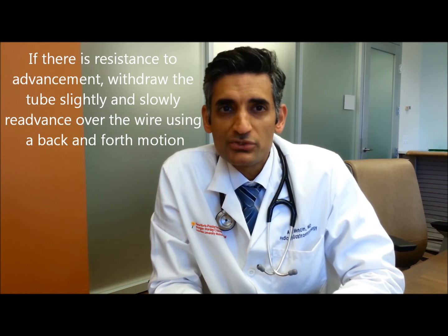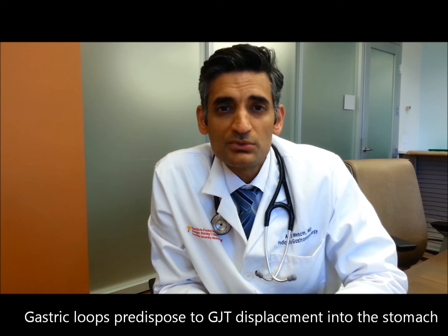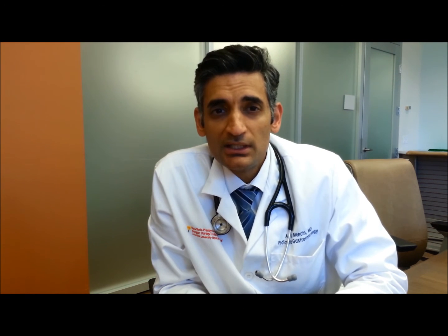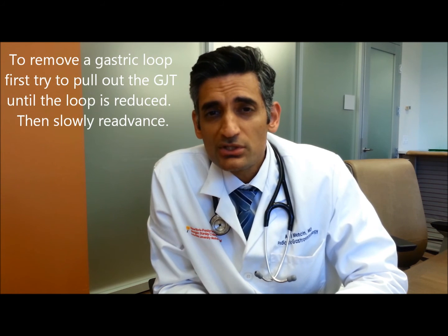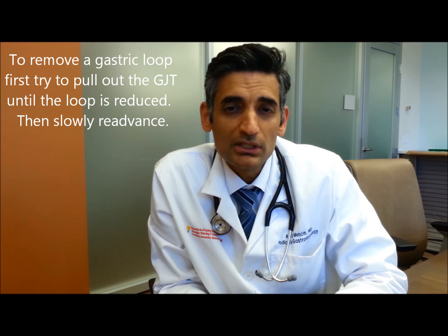Finally, slowly advance the GJ tube over the wire using a back-and-forth motion when encountering resistance, and generously lubricate the wire and outer aspect of the tube to promote movement into place. This should prevent looping in the stomach. Stomach loops are a problem because they can act as a traction point for the tube to get pulled back into the stomach. If you get a loop, try reducing it by pulling out the tube and then re-advancing slowly. You can also re-scope the patient.